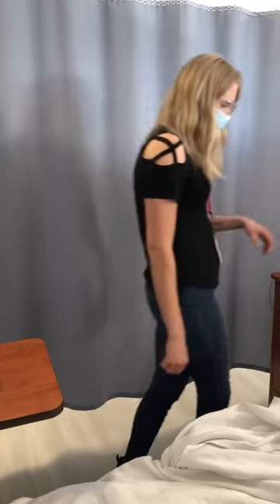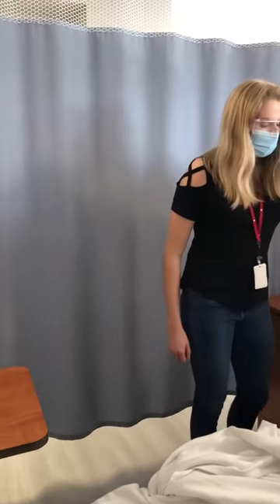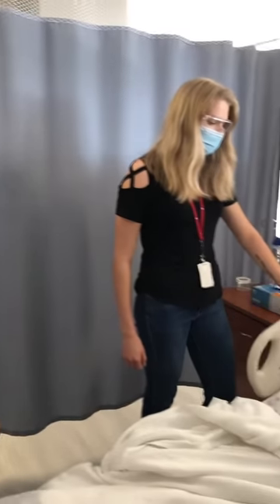My name is Abby and I'm going to be your nurse today. Would you be able to verify your full name and date of birth for me? Yes, it's Albert Jones, 19 June 1967.